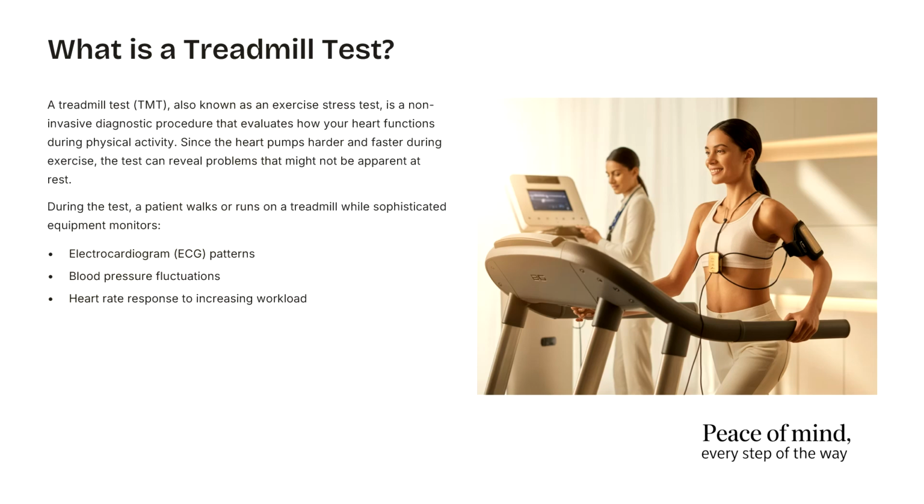So, what is the treadmill test? Treadmill test or TMT, also known as exercise stress test, means when a body is under exercise, like when a person is running or working on a treadmill. It's an exercise and it provides some stress on the body. And it's a non-invasive diagnostic procedure, meaning no needle or anything is inserted inside the body. The test is done outside the body that evaluates how your heart functions during physical activity. So it is aimed to see the activities of the heart.